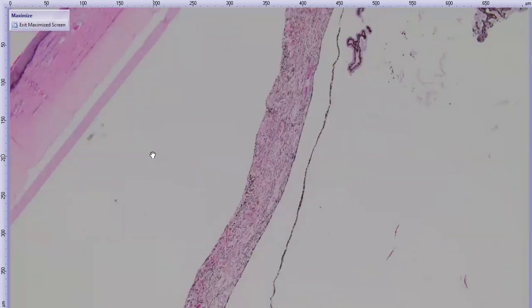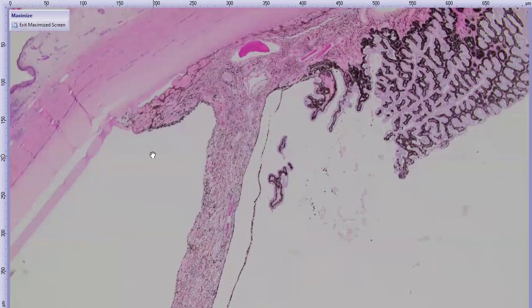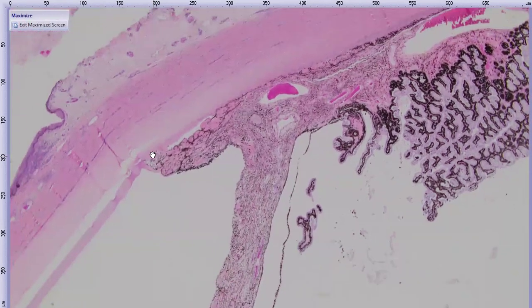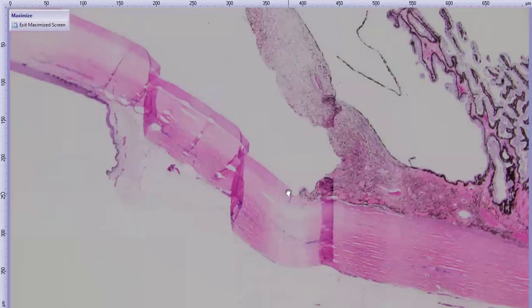Another lesion. Okay, so we don't have time to get into iridocorneal angles of horses, and I'm actually glad about it. They look weird. They usually have this very thick pectinate ligament, right? And you want to make something out of it, like this is abnormal, but we see that in normal horses. We see that in non-glaucomatous horses. So that's unlikely to be the cause of the glaucoma here.